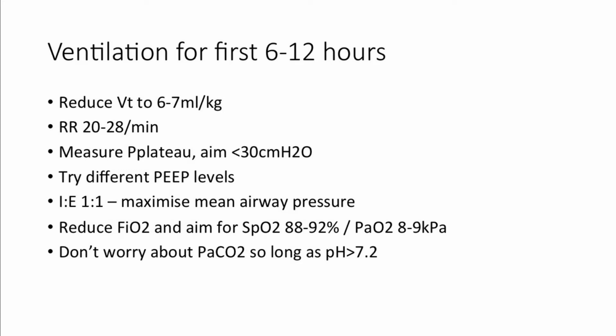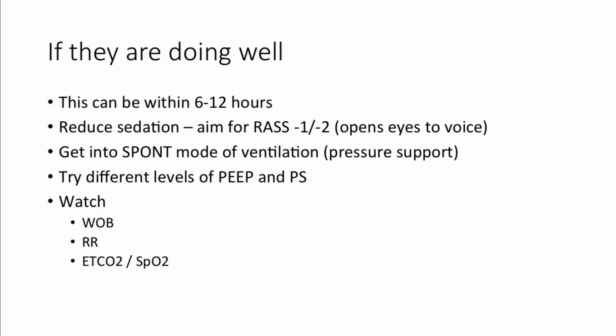Do you get any rebreathing if you've just got an IE ratio on? Like, do you give them enough time? So you can look at the expiratory flow. I haven't added that to the talk yet, but you can examine the flow waveforms and see if they finish breathing out. Okay. Yeah. So sometimes you can accept a little bit of gas trapping, which we'll come to next.